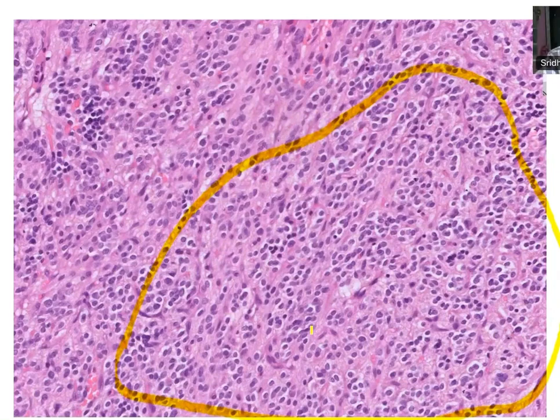So glial tumor. If a glial tumor, higher grade or lower grade? Mostly high grade. Why mostly? It is cellular, so it has to be. If there is any component which is high grade, you have to assign it as a high grade tumor. It's not mostly. Necrosis is there, cellular crowding is there. Probably we didn't look hard for the mitosis, but definitely.